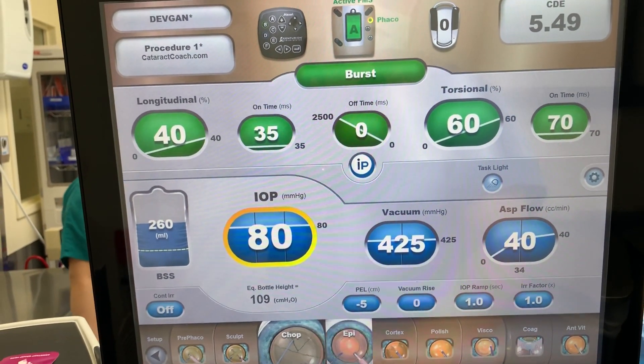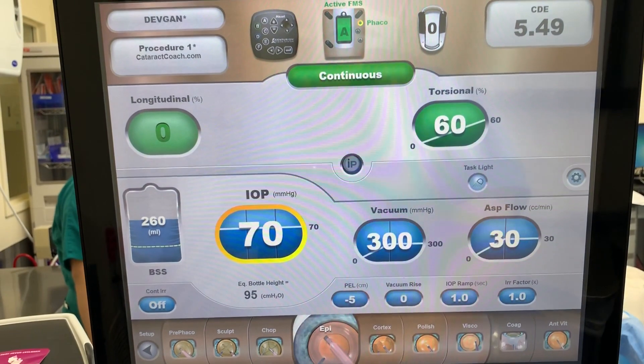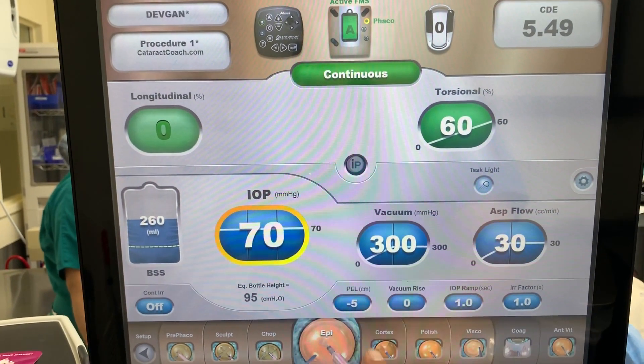Epi-nucleus mode is just to remove that soft epi-nucleus shell. You don't need much energy. This is fine.